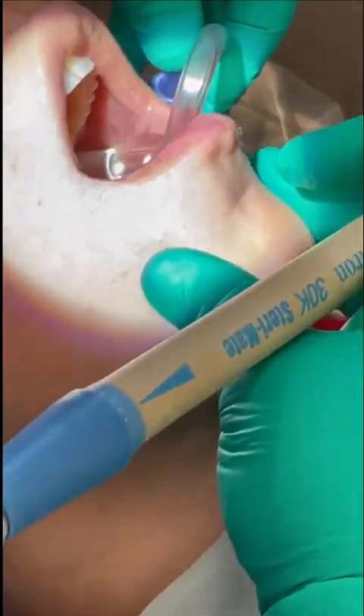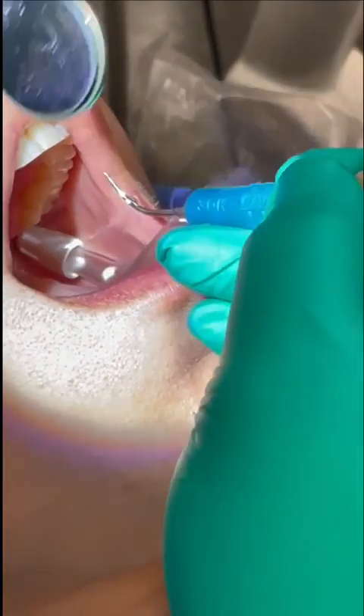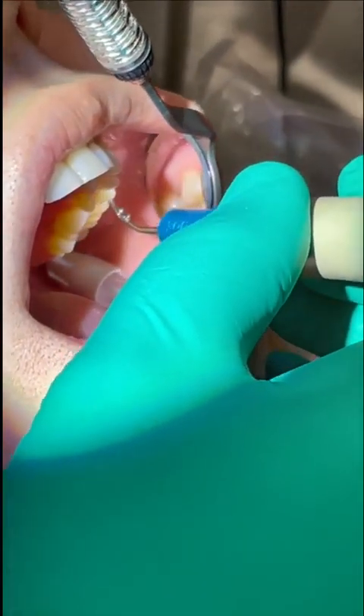I always start seated at the nine o'clock position, beginning on the upper left side, just because I'm comfortable with that, but you could start wherever you feel comfortable. I do my bend in the saliva ejector that I talked about previously, and I have the patient turn towards the side that I'm working on. I'll start with the posterior and move anteriorly, instrumenting either all sides away from me or all sides towards me.